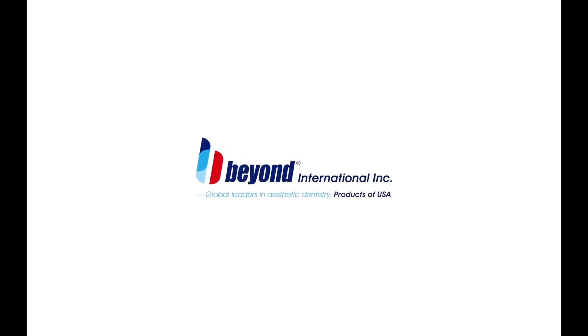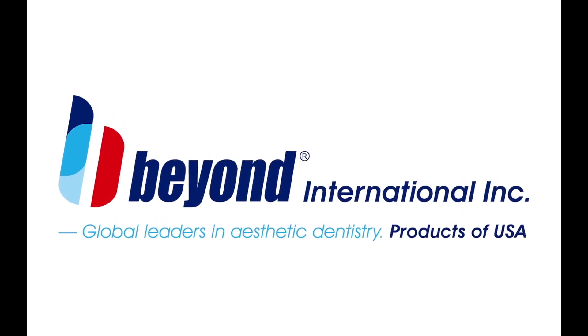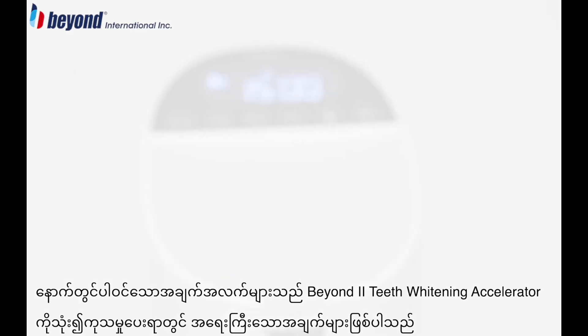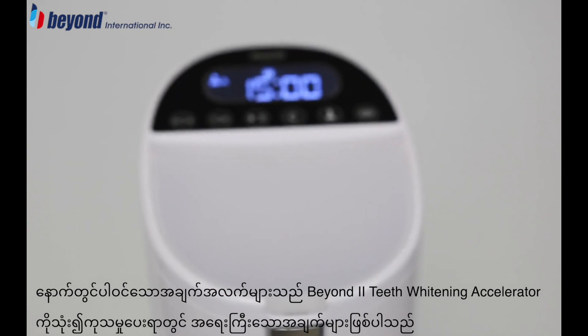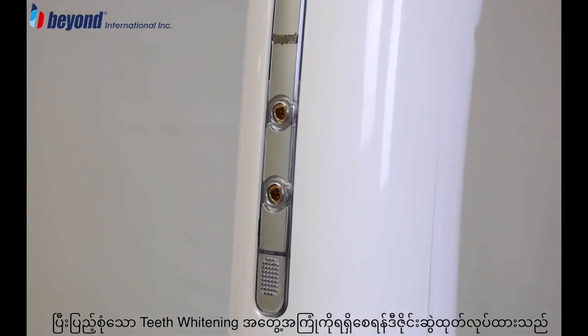Beyond International, global leaders in aesthetic dentistry. The following instructions outline a treatment procedure for the Beyond 2 Teeth Whitening Accelerator, custom designed to deliver the ultimate whitening experience.